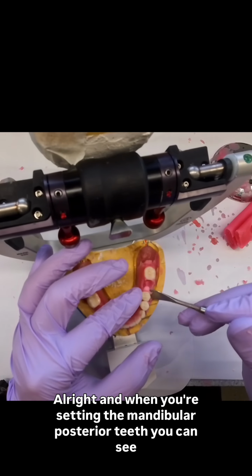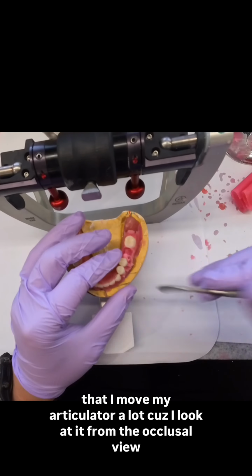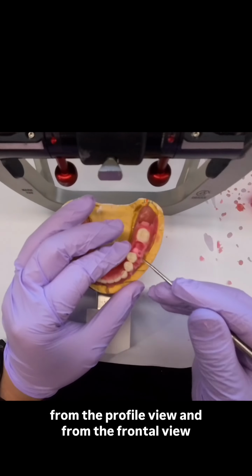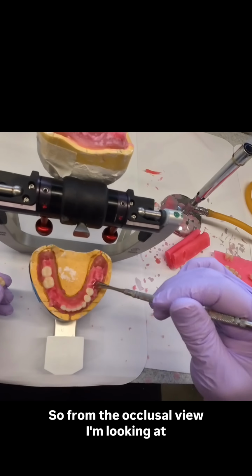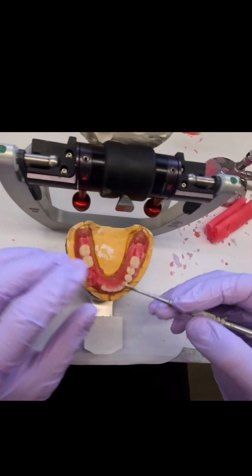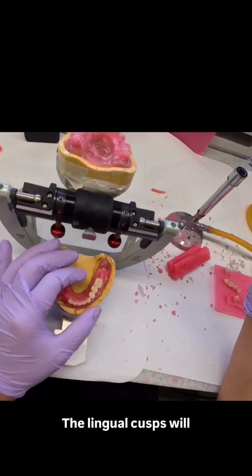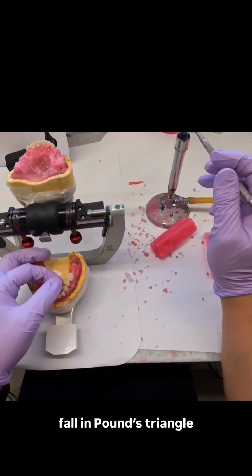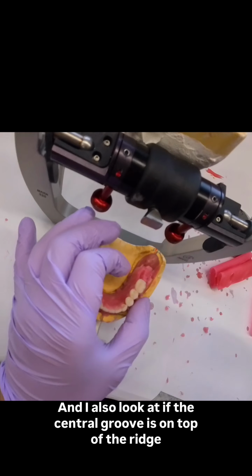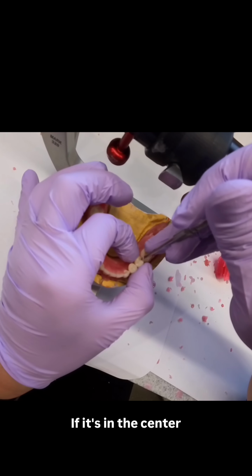Alright, and when you're setting the mandibular posterior teeth, you can see that I move my articulator a lot because I look at it from the occlusal view, from the profile view, and from the frontal view. So from the occlusal view, I'm looking at if the teeth are falling into the lingual cusp, they fall in Pound's triangle. And I also look at if the central groove is on top of the ridge, if it's in the center.